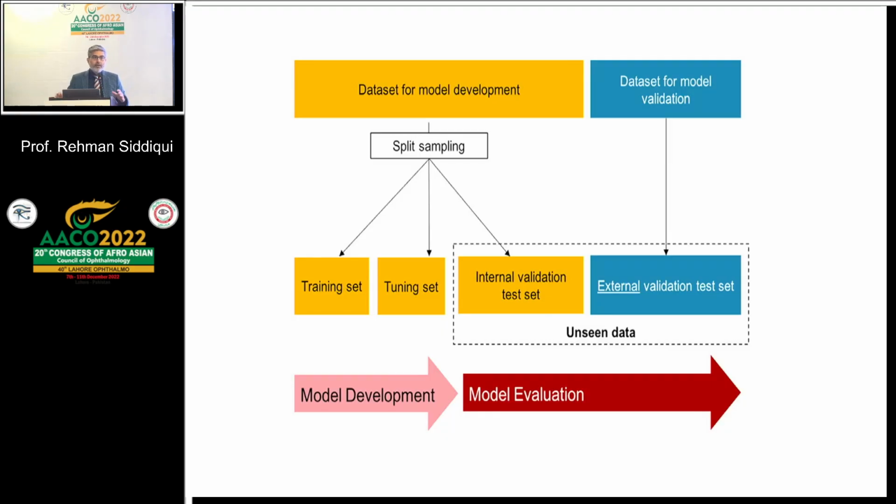The problem is that a lot of studies publish what they have. If you have features of diabetic retinopathy and features of no diabetic retinopathy, they look at those images, then they train, and then they validate the database on itself without doing external validation. And if you don't do external validation, you don't know how good your model is, because sometimes models learn features which we are unaware of.